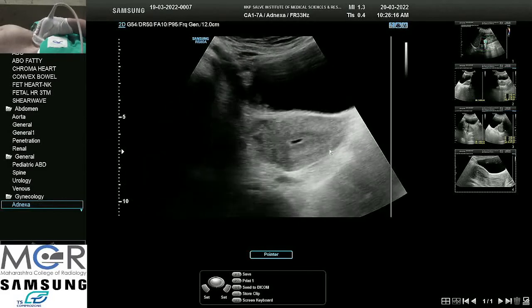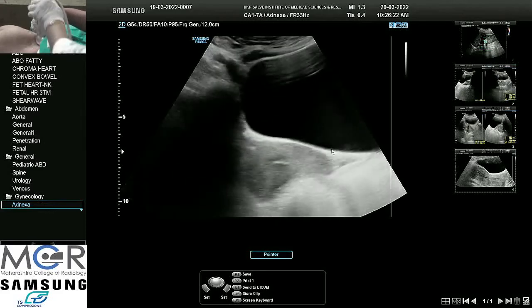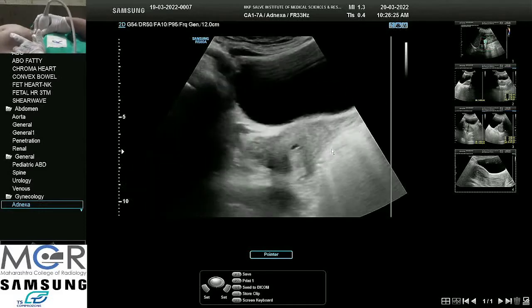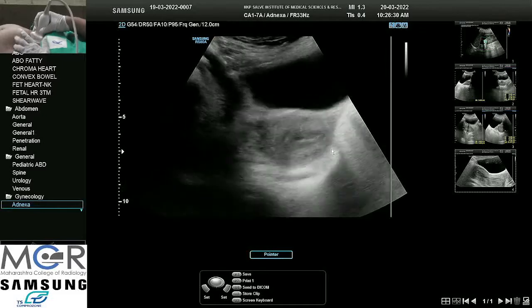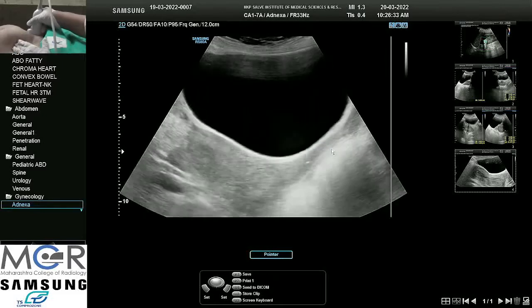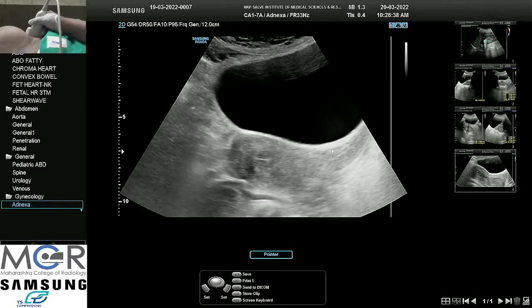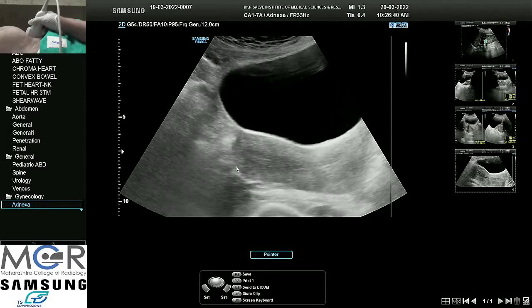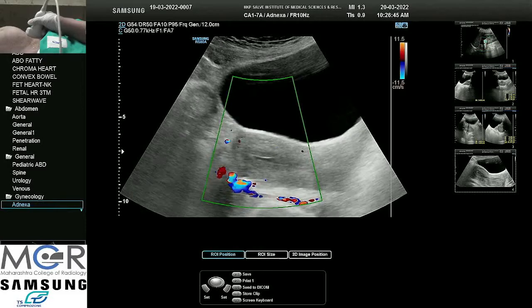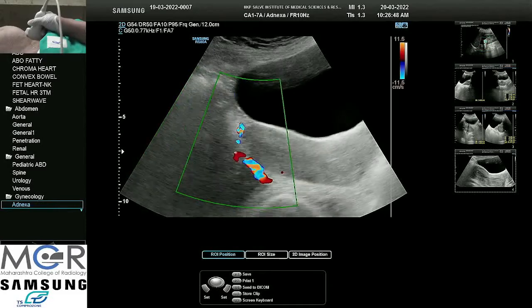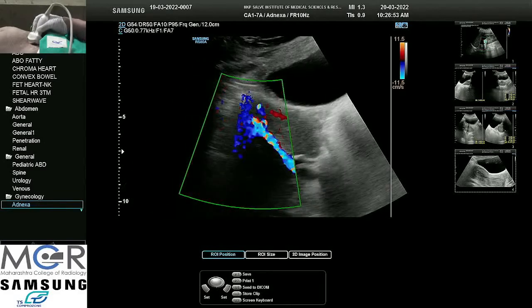We will try to see the right ovary as well. Before we do a transvaginal sonography, it is mandatory to do a transabdominal sonography first, because there are times you may not be in a position to see ovaries if they are very high up. I would like to put color here to trace the right ovary. We all know that the ovaries are in relation to the internal iliac.